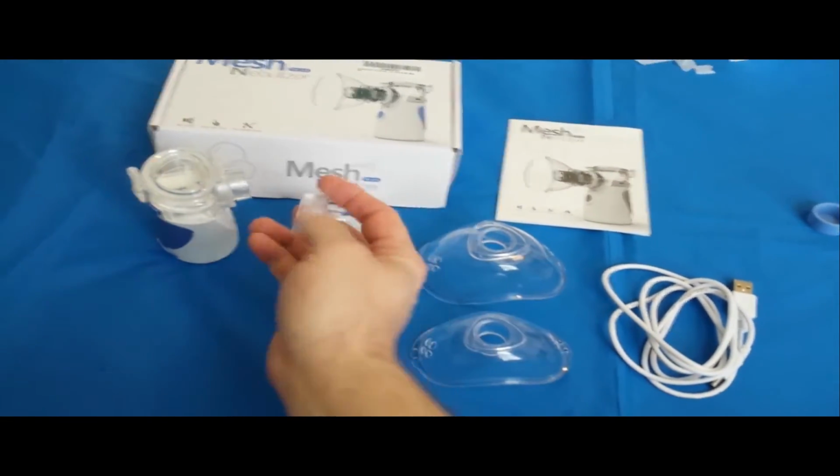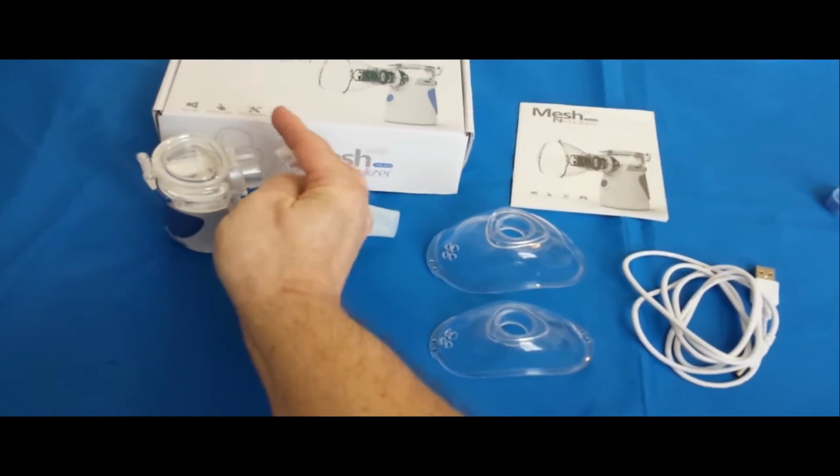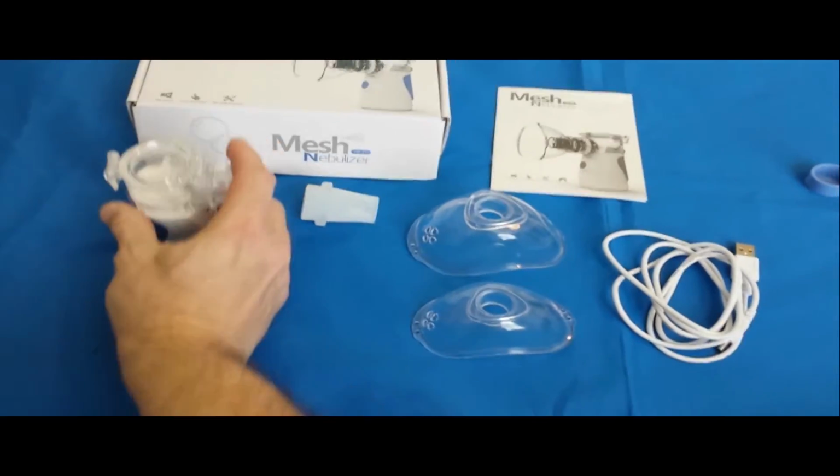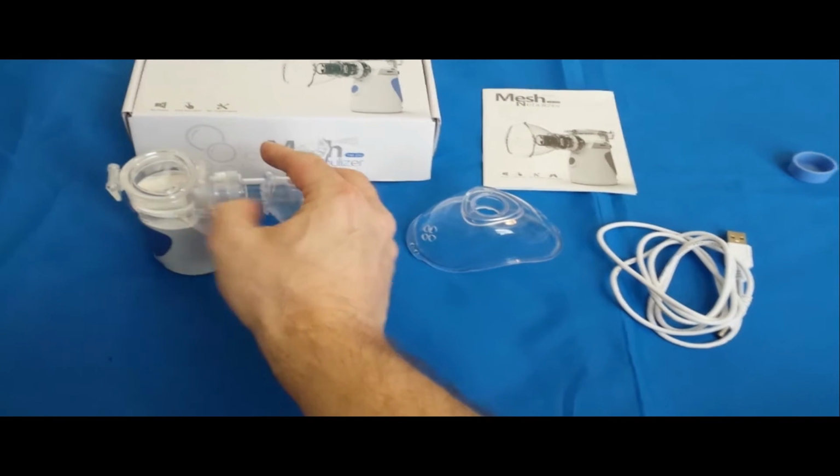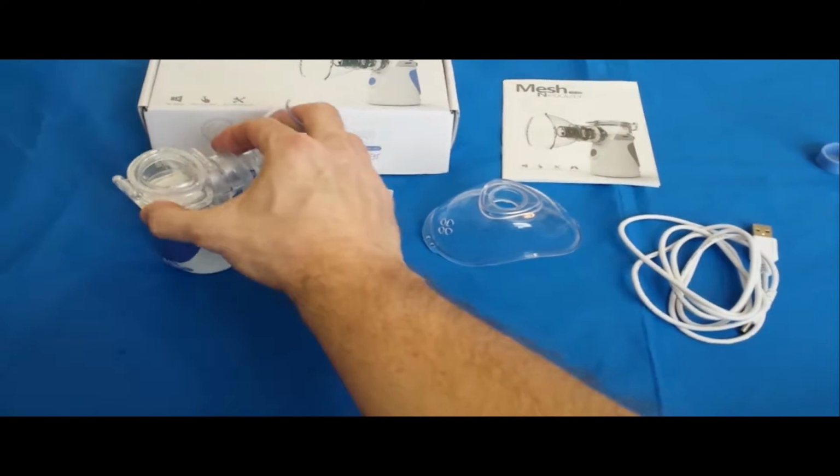When you use these face masks, you attach the adapter to the unit. Then you take one of the face masks, depending on size.